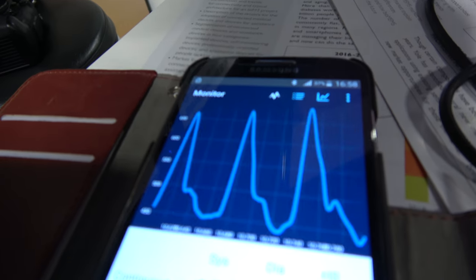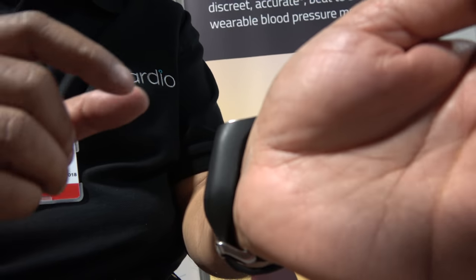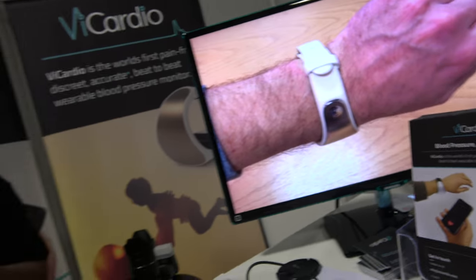What we're seeing in real time is my beat-to-beat arterial blood pressure, being taken by this device. With every heartbeat it measures systolic and diastolic blood pressure, which is essentially equivalent to having an intra-arterial line — something you'd only have in intensive care. It's very accurate and gives a lot of information.